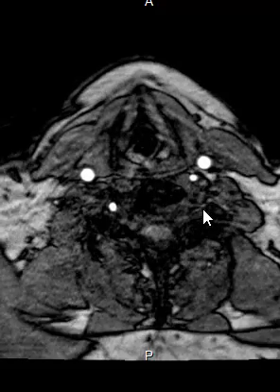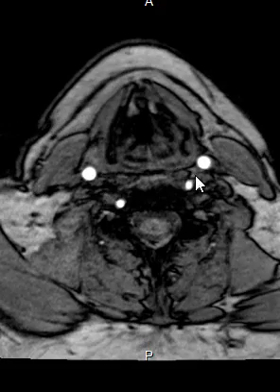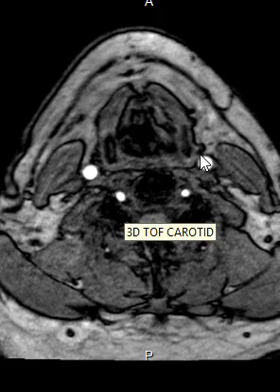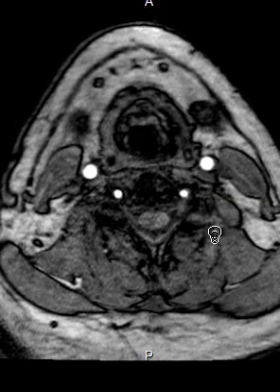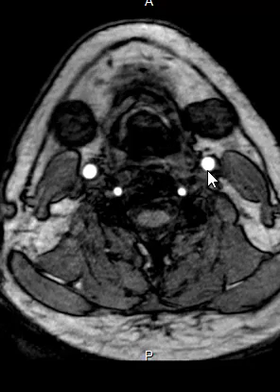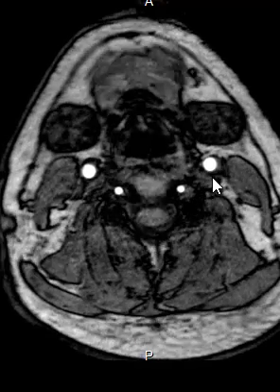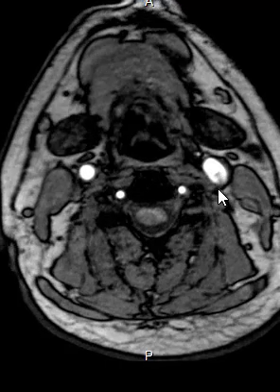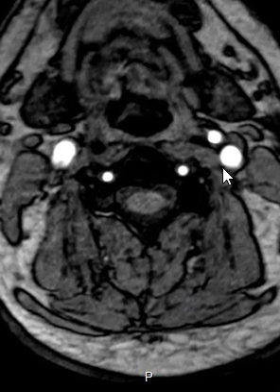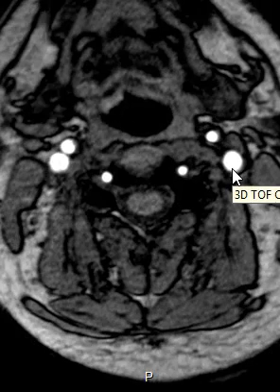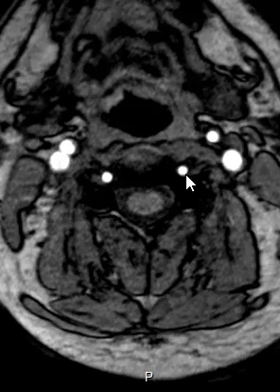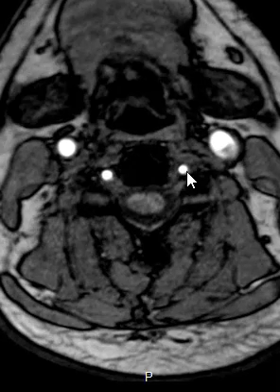We go through images slicing through the neck, and again the blood vessels are really bright. In the back we have the vertebral arteries, and in the front we have the carotid arteries. As we follow the carotid arteries up, this is called the common carotid artery, and on the left it branches into a large and small division. Here's where it's branching — we have the left internal carotid artery that's large and back, and the external carotid artery that's smaller up front. This is the vertebral artery, which does not branch.